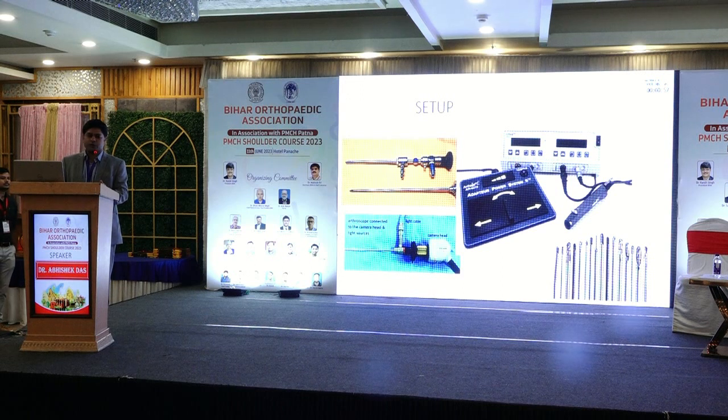Sometimes one shaver is good enough, but you will feel that you are stuck. You may need, rather than a 4 millimeter, a 5 millimeter shaver. With a burr, sometimes 4 millimeter is not good enough. It is not doing the job. The bone is very hard. You might need a 5.5 burr. So slowly and steadily you'll get used to it, but try and have at least one shaver and a burr with you all the time.